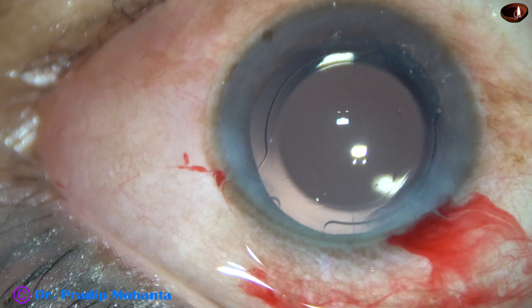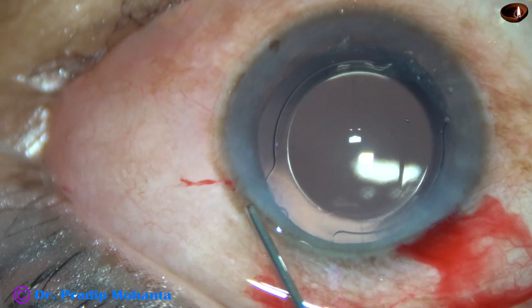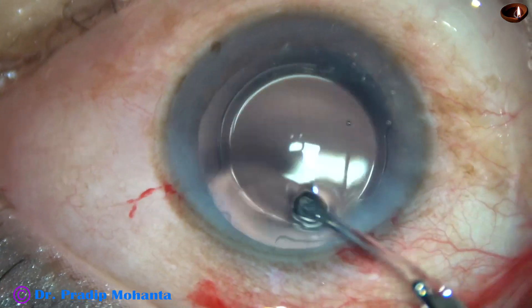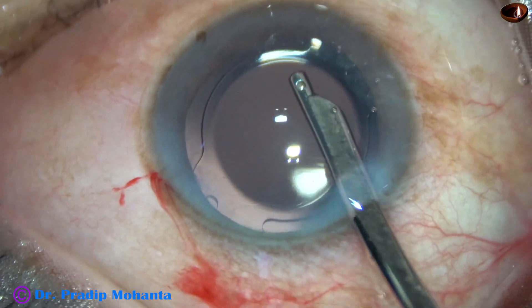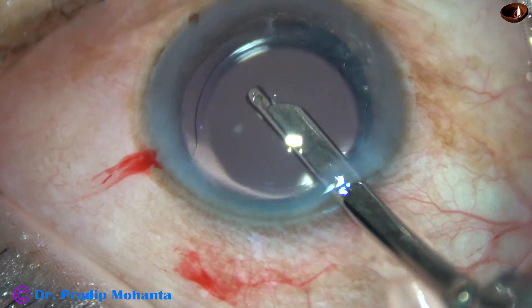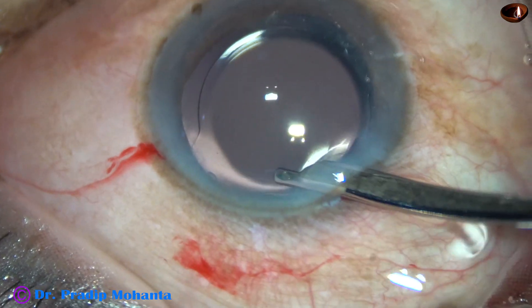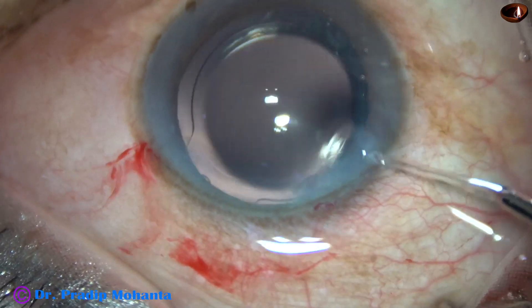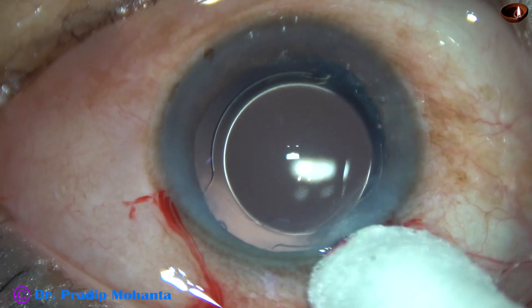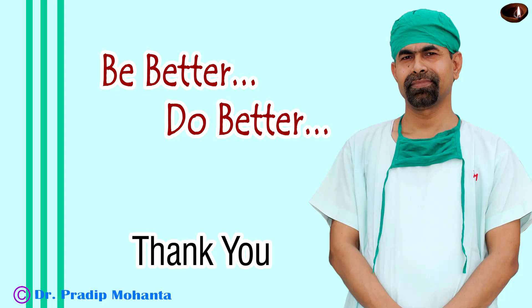The side port is closed by corneal stromal hydration. In this case, I made only one side port. And now a final refilling of the anterior chamber. The anterior chamber is nicely formed and the case is concluded. After checking the wounds, there should not be any leakage from any wound. A few drops of antibiotic are applied over the ocular surface, and the case is concluded. Thank you very much for your attention.